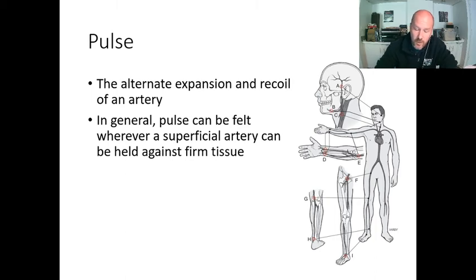We'll talk more about why that's the case, but particularly when you're giving contrast, there's a kind of anxiety attack that people can have when you give them contrast that looks a lot like a contrast reaction. It's not. It's just an anxiety attack, but it involves projectile vomiting and all sorts of crazy stuff, like from the movie The Exorcist, and it's just an anxiety attack, right? But pulse would be a first sign that the person's anxious.